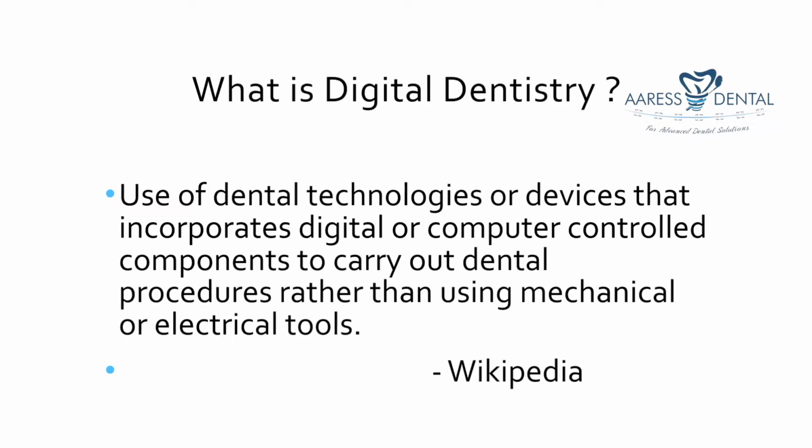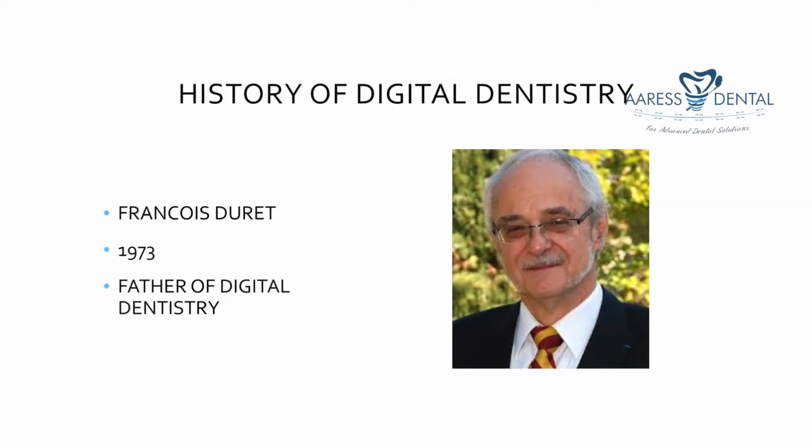Digital dentistry is the use of dental technologies or devices that incorporate digital or computer control components to carry out dental procedures rather than using mechanical or electrical tools. Digital dentistry was started way back in 1973 by Dr. Francois Duret, who is also considered the father of digital dentistry.